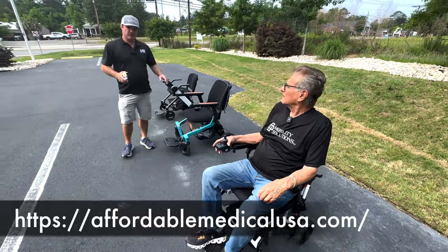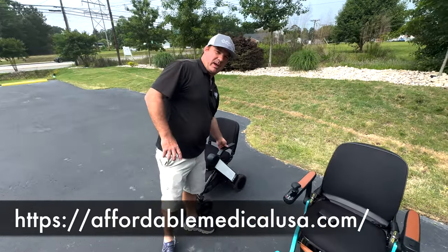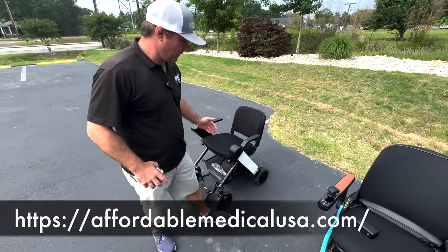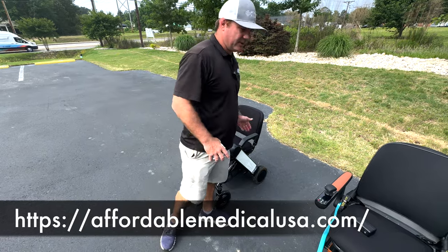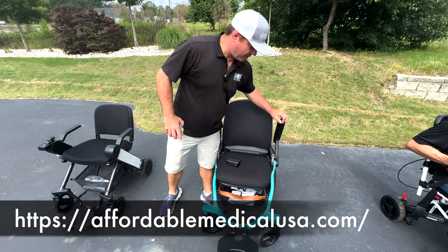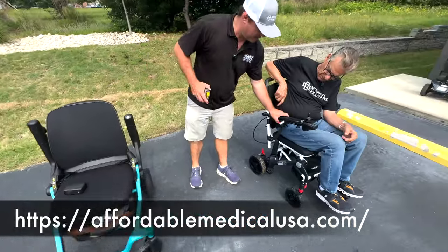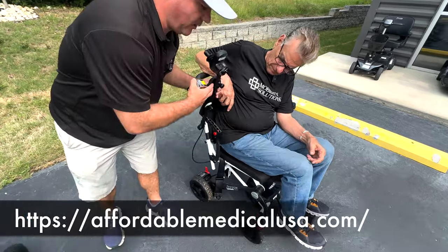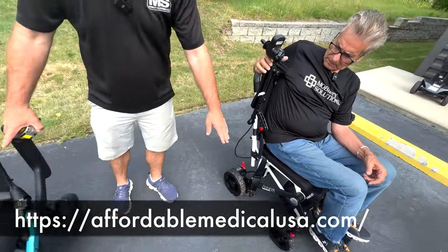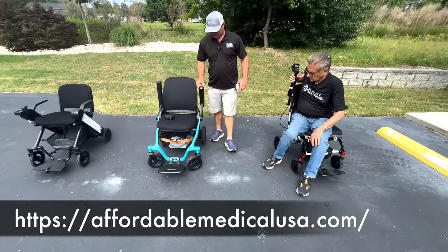I will mention to you really quick before we get into a lot of other stuff. These don't flip back. So if you're a transfer, you have to come out the front. If you had a transfer from right to left, can't do it. This one does have the arms that flip back, and so does the carbon. You can flip this back. So that's a kind of a big deal. Just throw that out there. I will say that this one gets way out of the way compared to these two. So it's easier to get in and out.